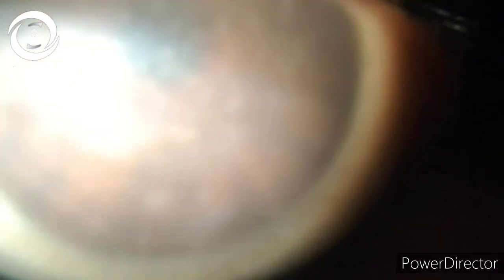Well, if you have watched the full video keenly, at the halfway stage I switched to the other eye and the disease was absolutely the same. So I showed you a case of exact same pathology in both eyes.